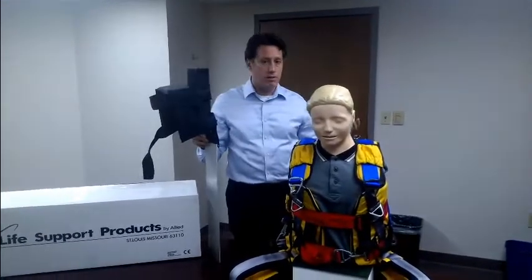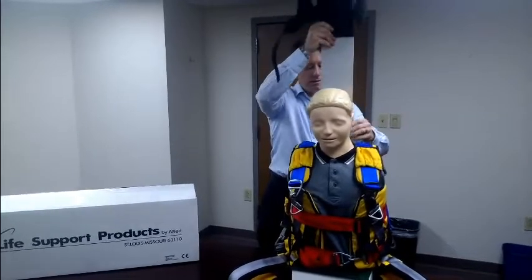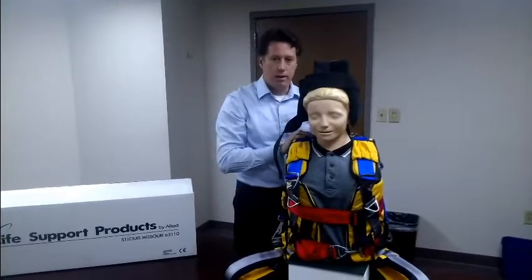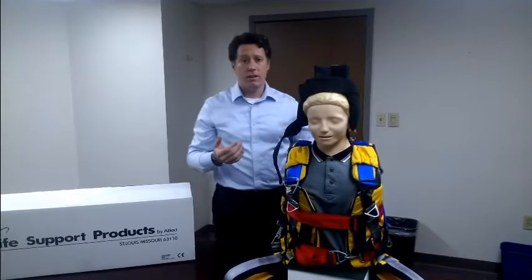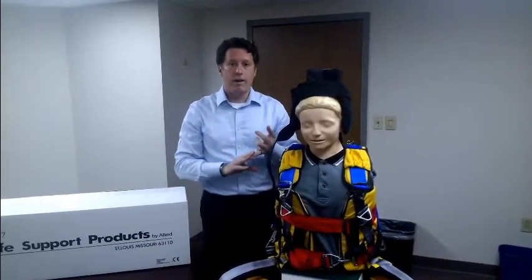If an injury occurs, immobilization becomes as simple as inserting the backstay and tightening the straps. It's a very unique design intended specifically for immobilization of a patient in a confined space where vertical lift is going to be needed.